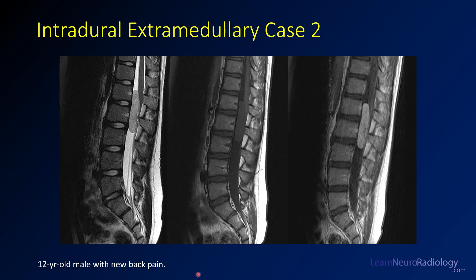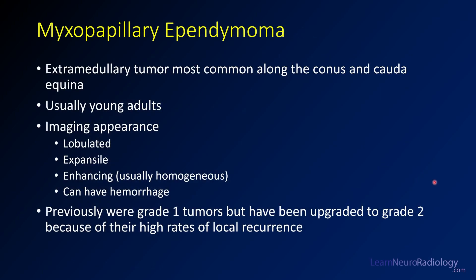Now moving on to case number two: a 12-year-old boy with new back pain. On T2 you see a well-demarcated lesion along the conus. On pre-contrast it's relatively isointense to the adjacent spinal cord. On post-contrast you see pretty avid enhancement with deflection of the spinal cord. This is an example of a myxopapillary ependymoma — common extramedullary tumors most often along the conus and cauda equina, usually in young adults and older children. The imaging tends to be lobulated and expansile with homogeneous enhancement; they can have areas of cystic degeneration and hemorrhage.